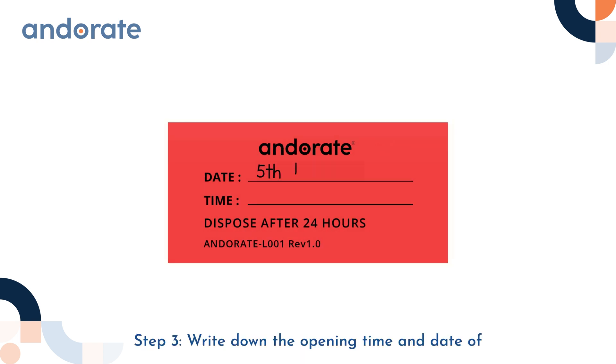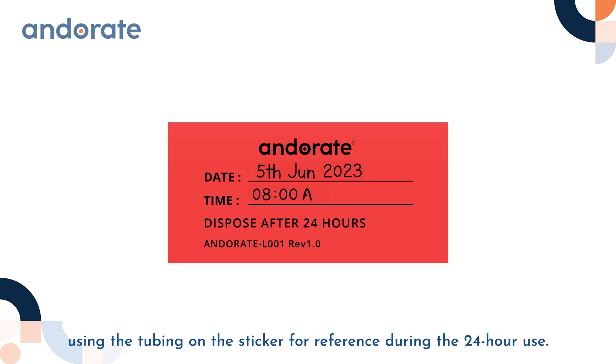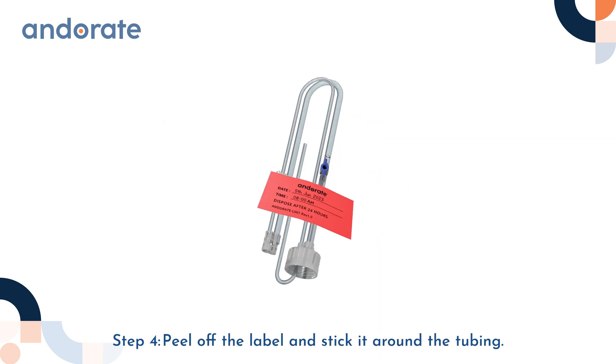Step 3: Write down the opening time and date of using the tubing on the sticker for reference during the 24-hour use. Step 4: Peel off the label and stick it around the tubing.